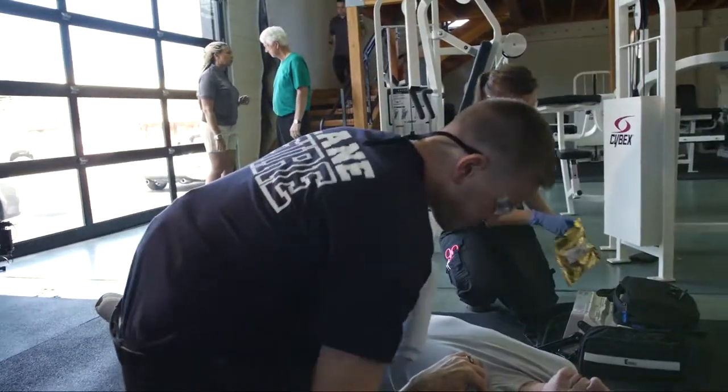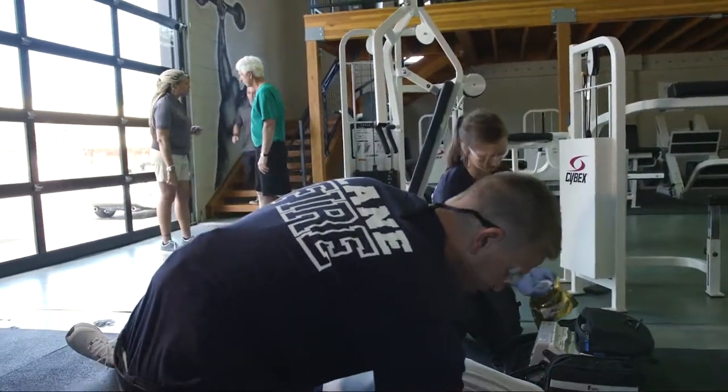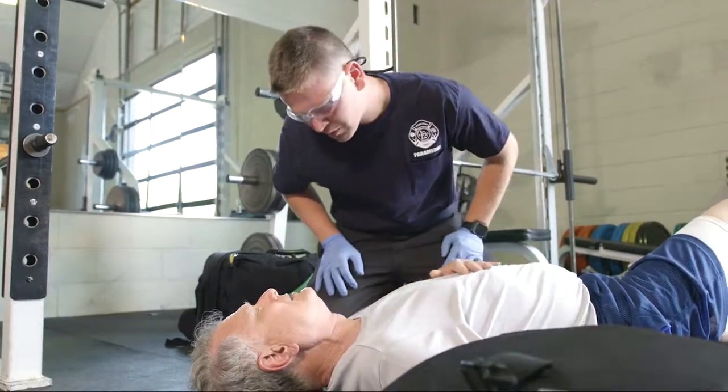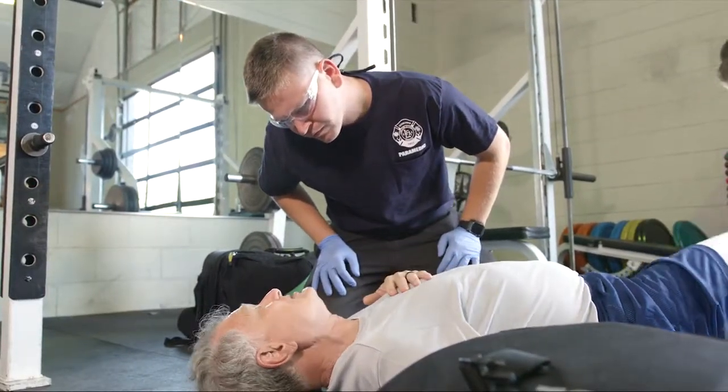Hey there, so what can we do to get you more comfortable? I have this towel here. Can I put this behind your head? Absolutely. Can I help at all? We're going to go up and do paperwork. If you'll just hang here. Yeah. If you had to rate it on a scale of 1 to 10, where would you put it right now? About 7 or 8.